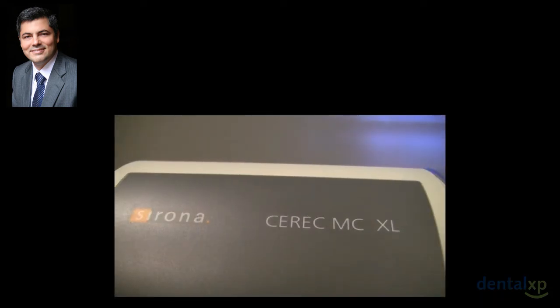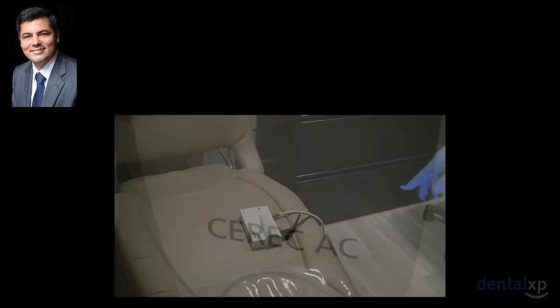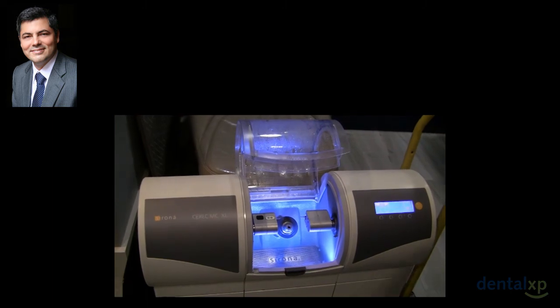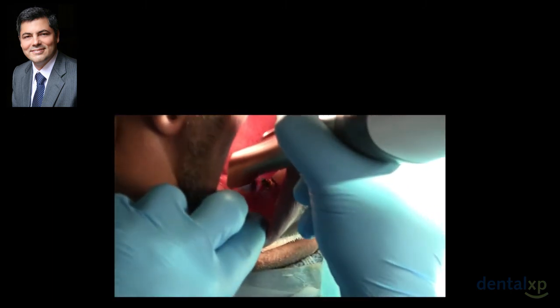It goes into the software, and in the software, we're going to do all the process of planning and computer-assisted manipulation of the design.